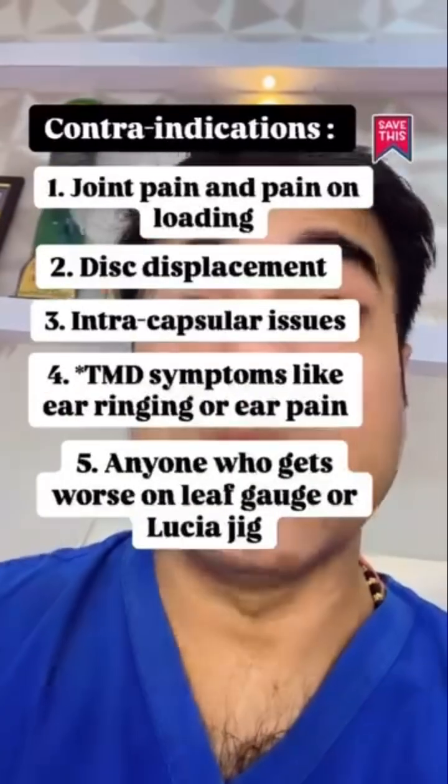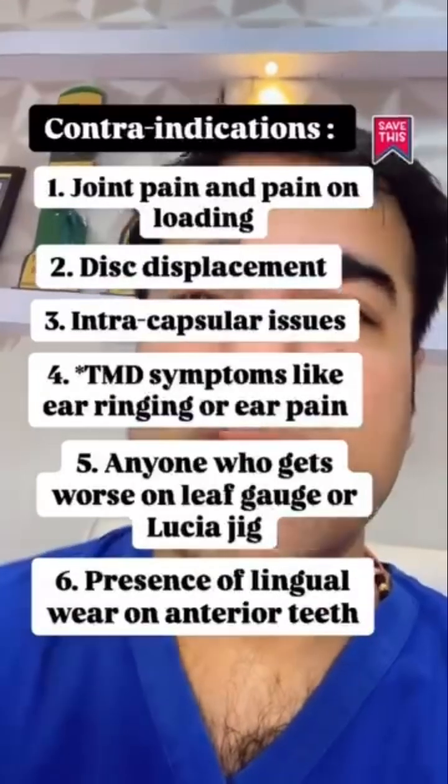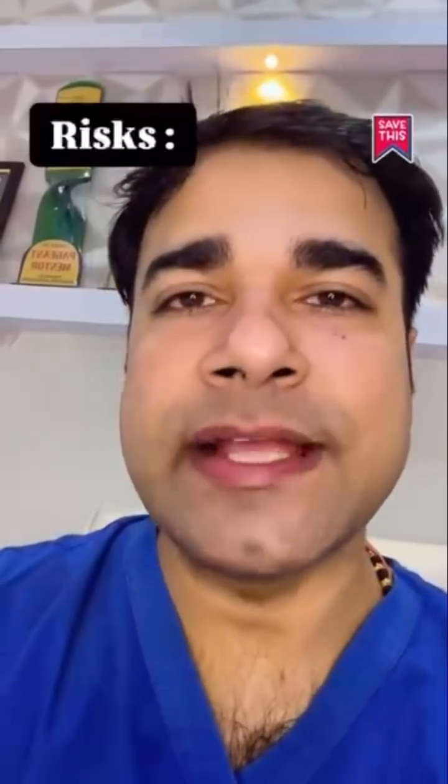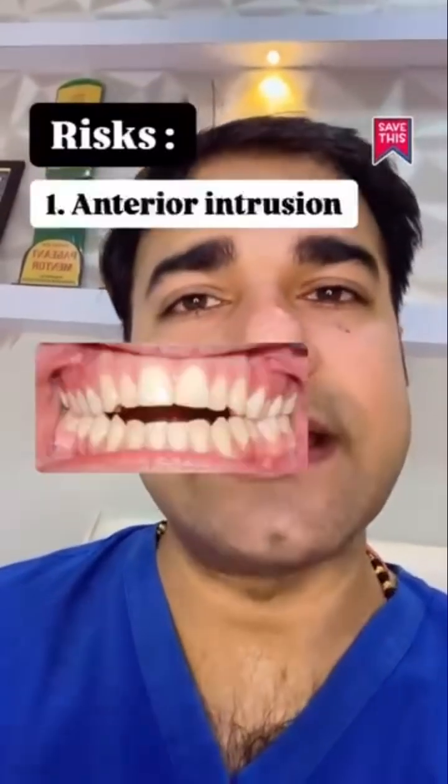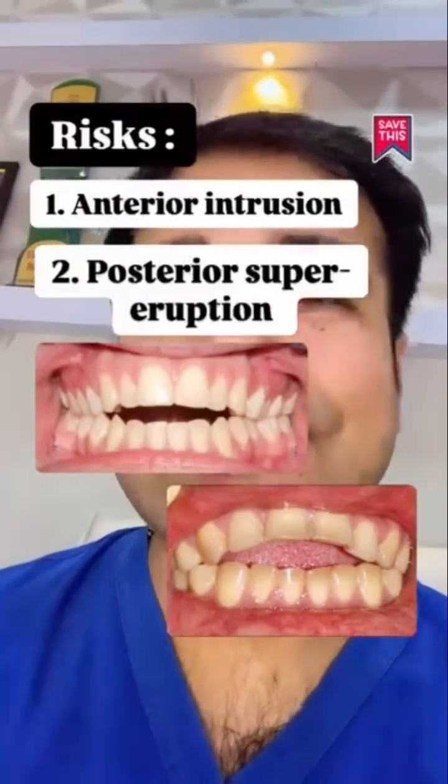Anyone who gets worse on leaf gauge or Lucia jig, or who has presence of lingual wear on the anterior teeth, should not use this appliance. The risks for using this appliance on a regular basis include anterior intrusion or posterior supra-eruption with excessive use.